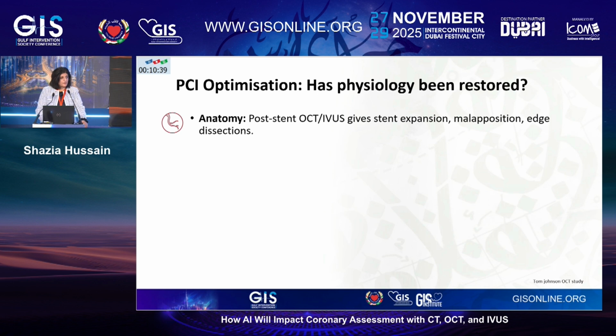And then moving on from that, so we've decided how we're going to do a case, and after the stenting procedure, AI can potentially tell us whether or not we've done a good enough job. So post-PCI FFR, I don't know many people who do that routinely. Anyone in the room who does post-PCI FFR? Okay, one. It's very rarely done, and that's because it involves instrumenting the vessel again, another pressure wire.